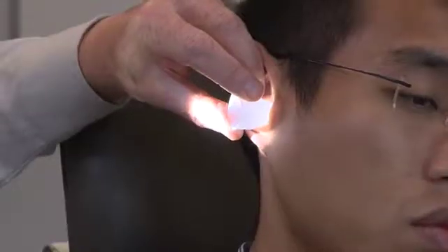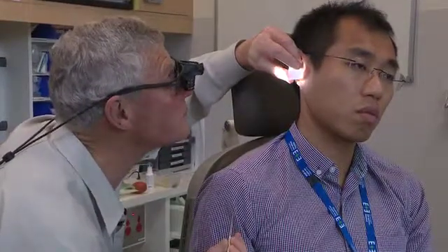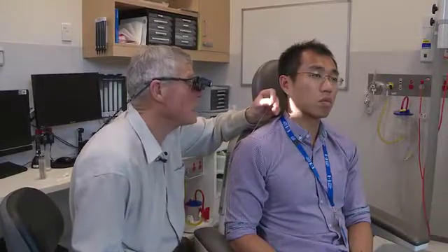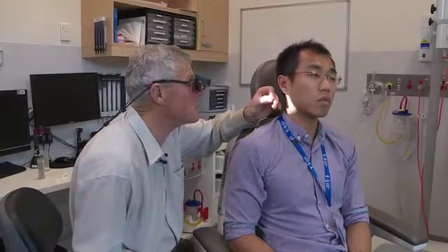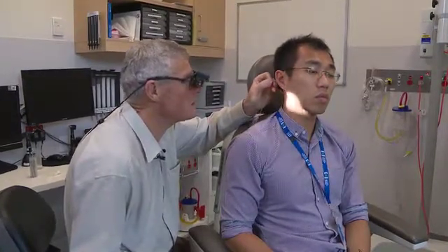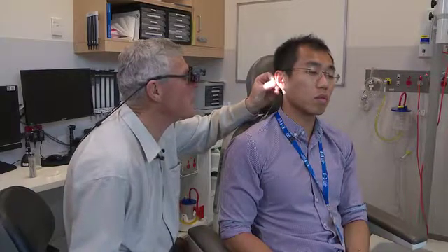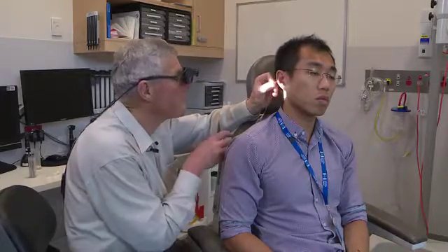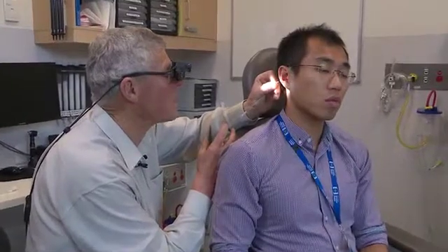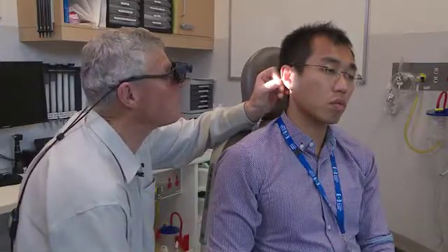Why do I know this more than most? Because I've spent a lot of my career dealing with small children. You eventually work out that you can remove wax from the deep ear canal without hurting people. This is a really quite useful thing we've started to realise more and more, especially when dealing with children who have a lot of ear infections — like Aboriginal children. One of the most effective things you can do to treat an infection — and I don't mean cellulitis and temperature and terrible pain, I just mean a seriously mucky ear that possibly hasn't got better with ear drops and oral antibiotics — it needs topical treatment. The best topical treatment is rinsing out with either betadine 1 in 10, or hydrogen peroxide 3%. Nobody has statistics to show whether one's better than the other. And if it's going to be effective, you need to use it at least three times a day. Therefore you've got to empower the family.